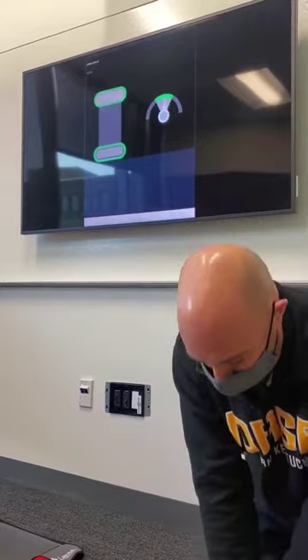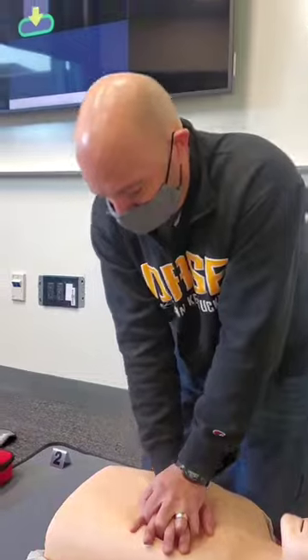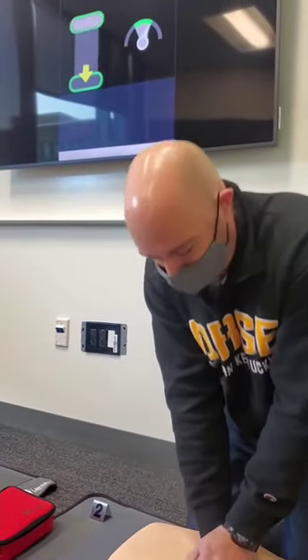If you look at the feedback, I'm reaching the heart. If I'm not pressing hard enough, you'll see an arrow on the screen showing that I need to press further down — harder.